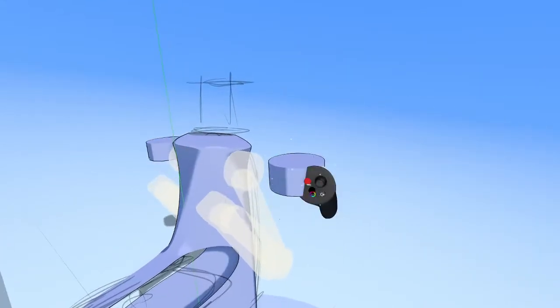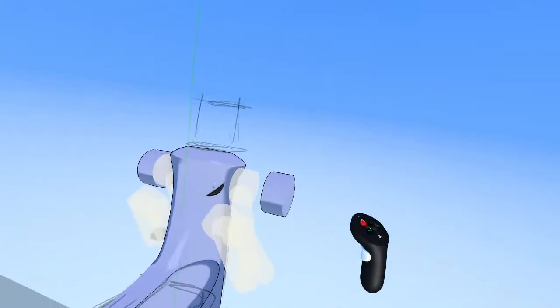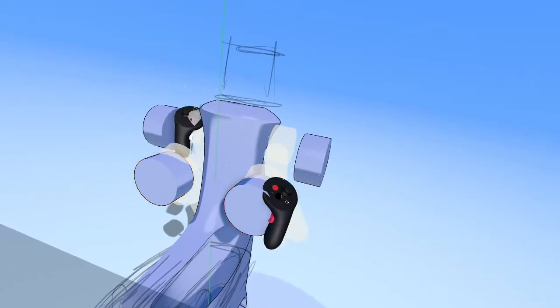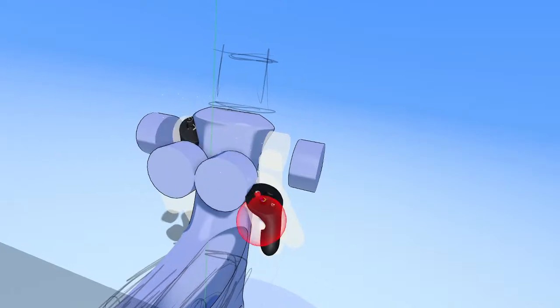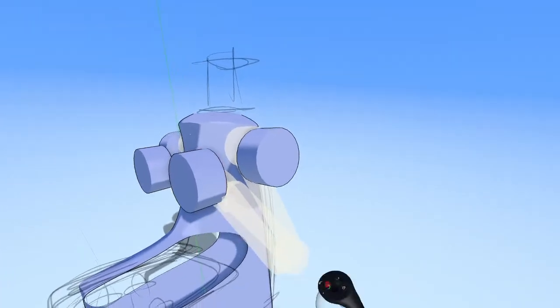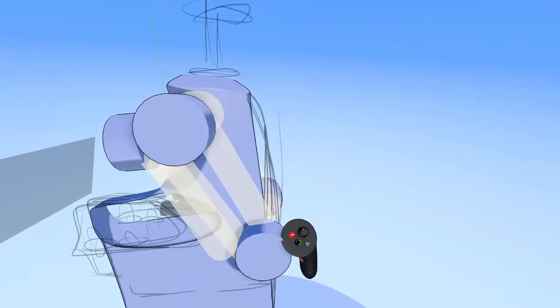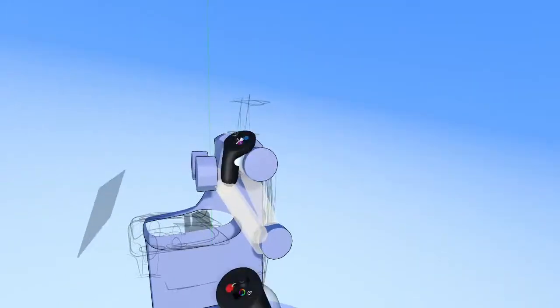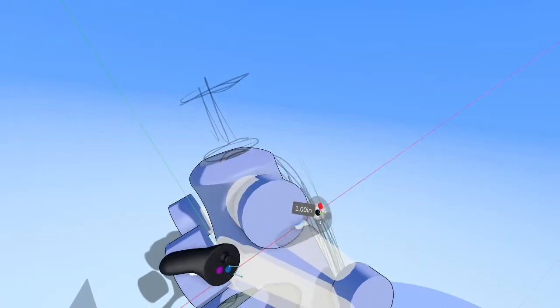Just like that. And because we still have grid on, we could just grab it and twist it so that it's facing the right way. Let's duplicate it, twist that so that it's facing the right way for that part of the arm. And then duplicate it one more time down for the elbow. So we have the shoulder, the elbow, and the wrist here. Now we can turn off the grid because we've placed it exactly the way we want it.